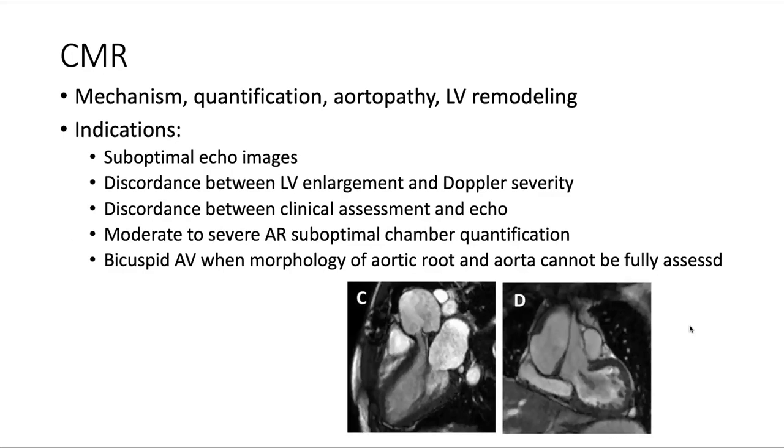Also, the ASE brings up cardiac MRI. Again, mechanism and quantification. For aortopathy, it's quite good, especially when performing an MRA. And then detailed assessment of LV remodeling.